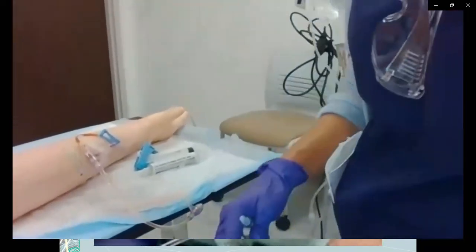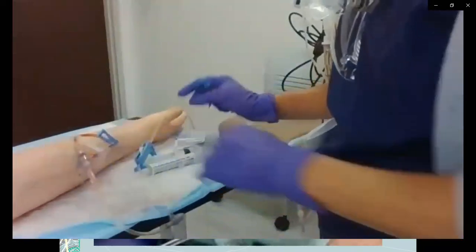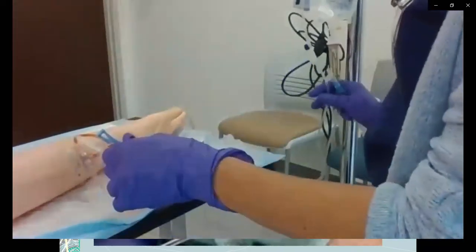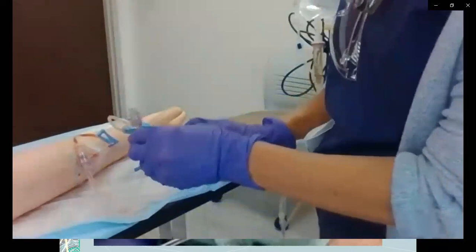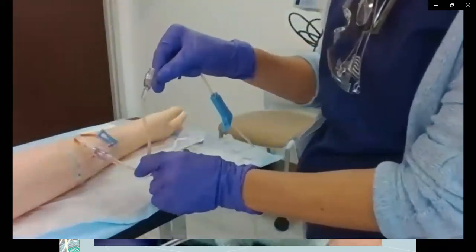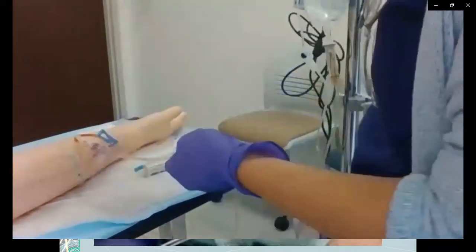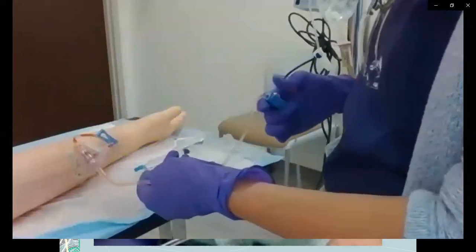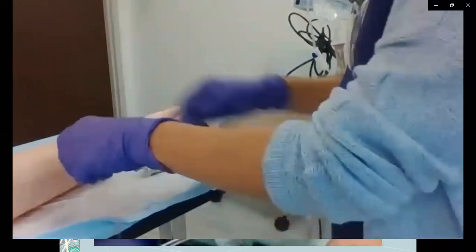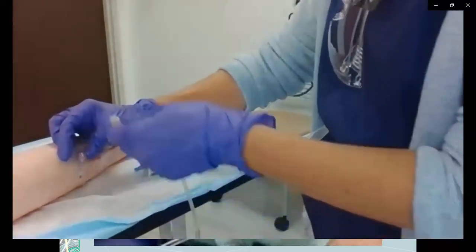So at the patient's bedside, I'm going to push this back down towards my patient's IV site. Again, assessing that site. If they've got primary fluids going, as this one does, then you will choose the port that is closest to your patient to give the IV push medication. If you are not hooked up to, and there's not IV fluids going, then you'll just go directly into that port there, okay?